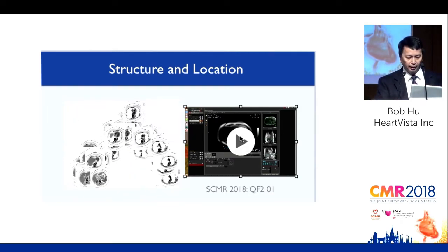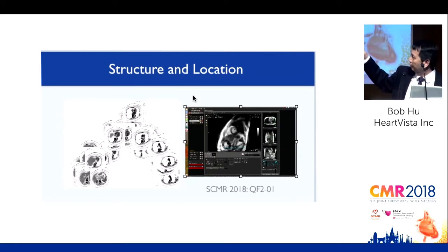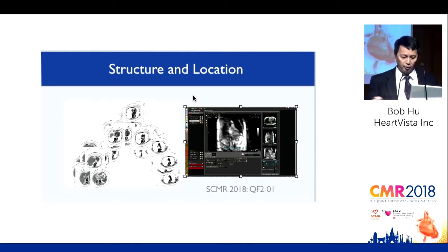So on the right-hand side here is actually a slightly different model, what we're using to localize and scan the imaging planes that we need in as little as 5 seconds, as you can see. Everything that you see is actually happening in real time. It's controlled by the machine. No one's touching the machine.